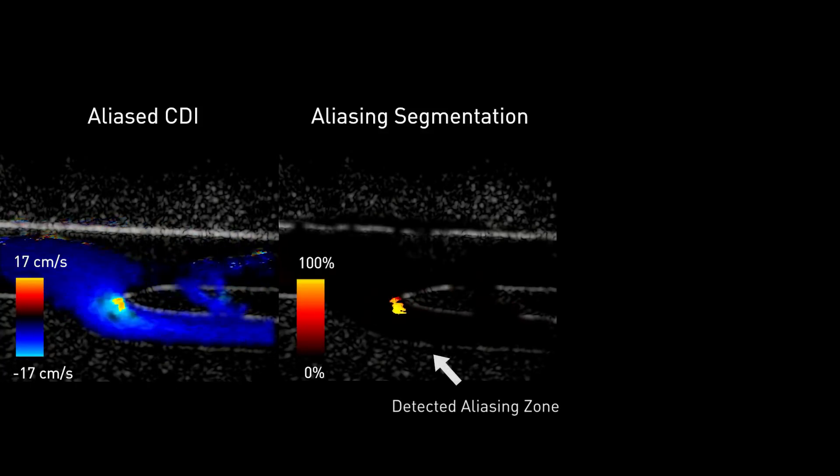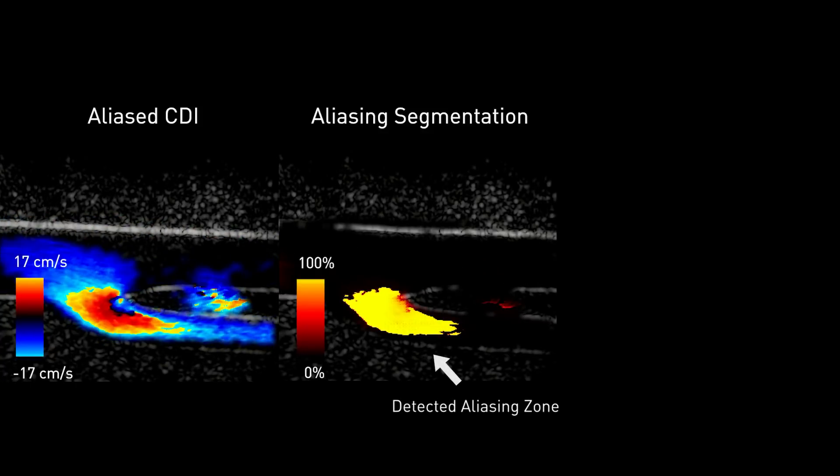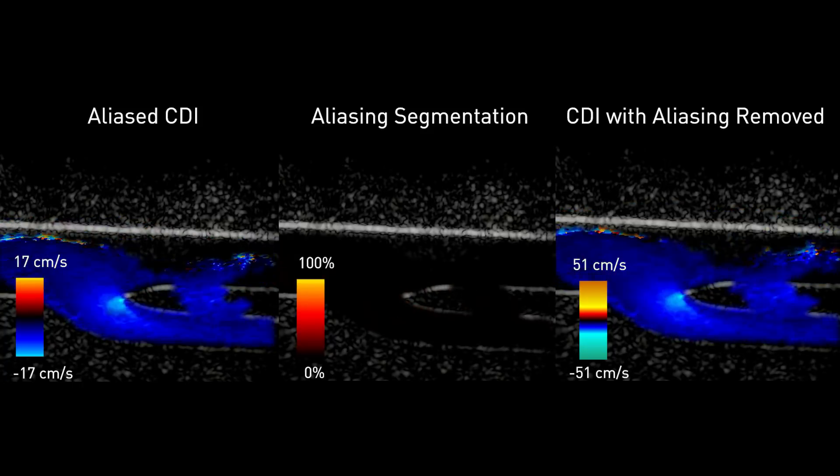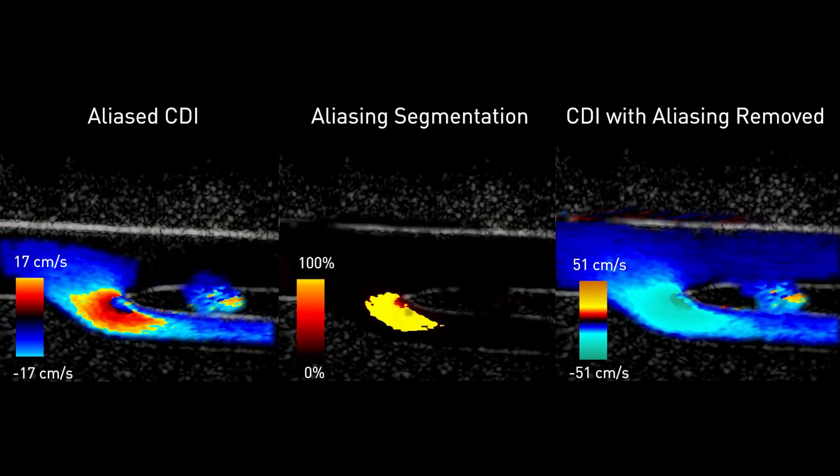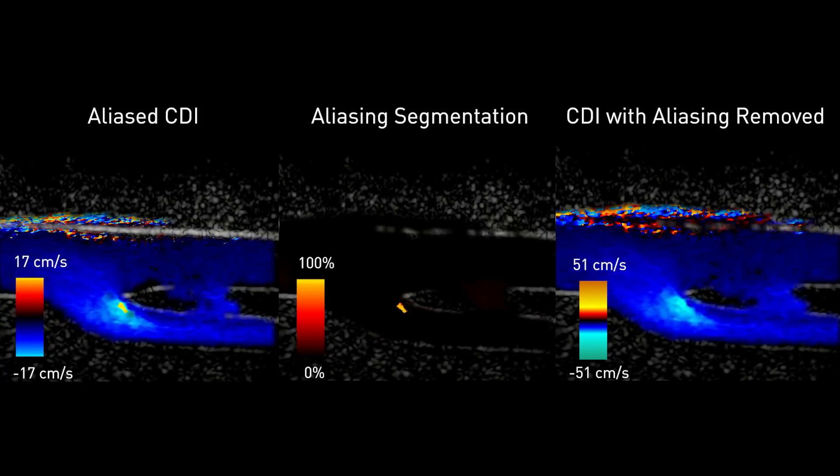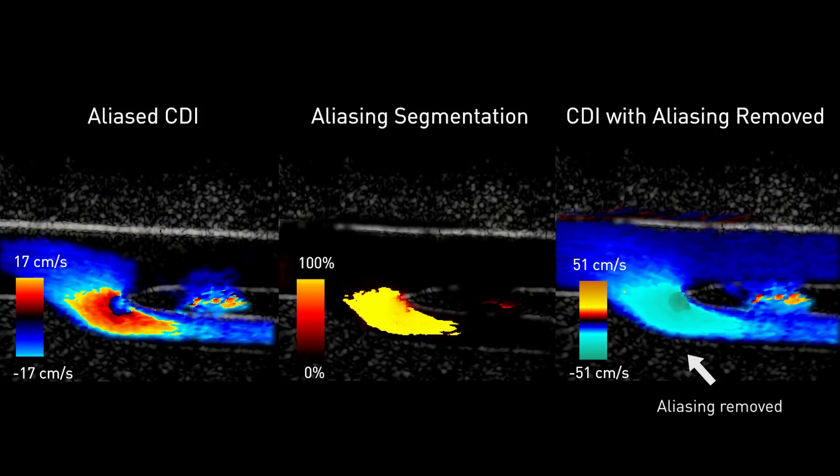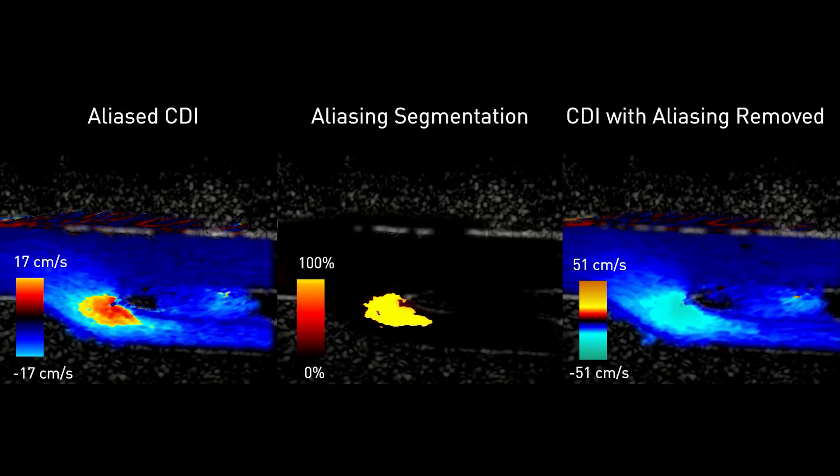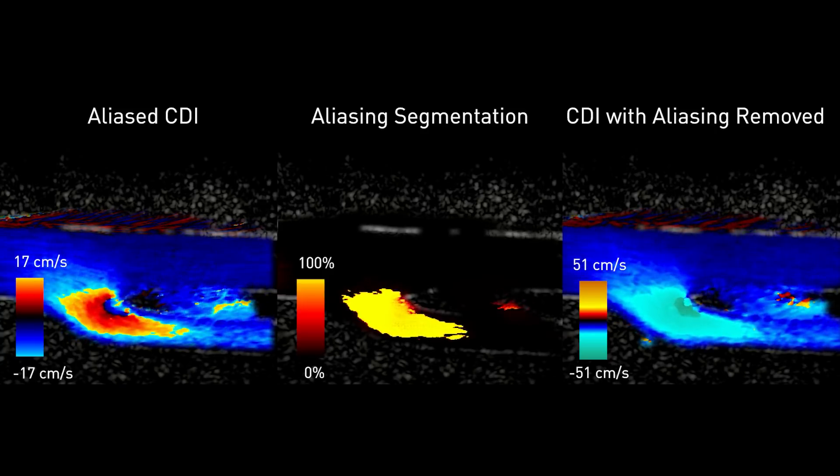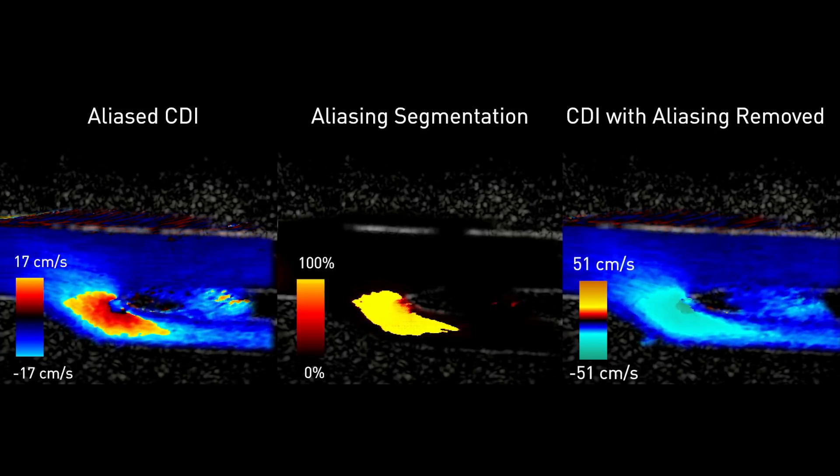The middle sequence shows that the AI was able to identify the aliasing in each frame in real time. On the right, with the deep learning power dealiasing mode enabled, the maximum detectable flow speed is increased. There are no more aliasing artifacts and the visualization of flow is now correct. We can replay the CDI in slow motion to really highlight the improvement in visualization.